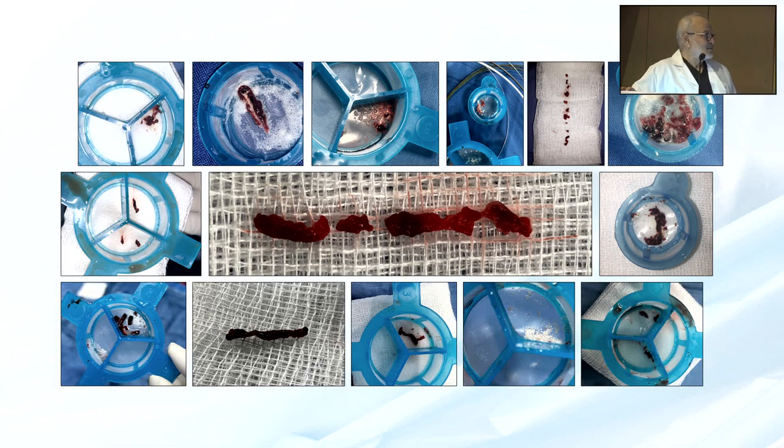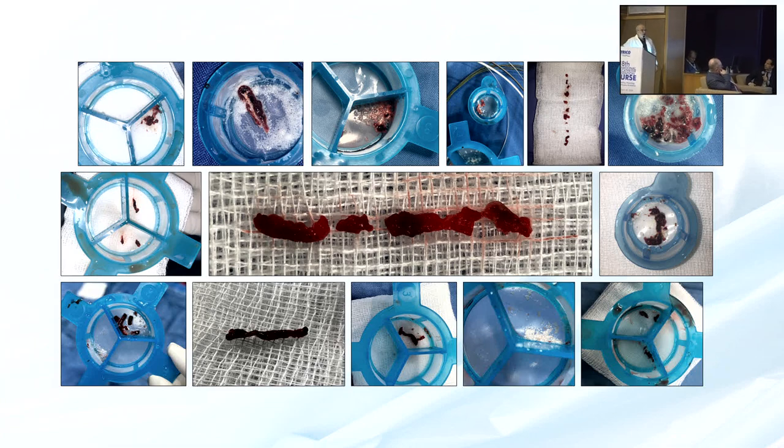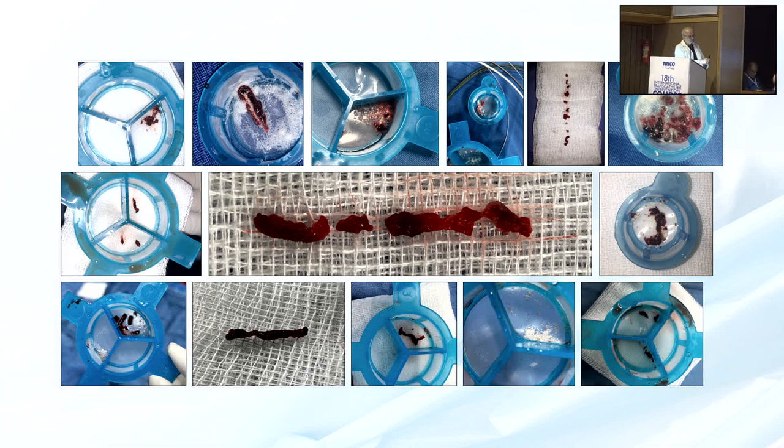Tej, if you had an embolization like a stroke, you must monitor for that, would you go and treat it in a similar manner? The first time, in that case I showed, I had to remove my guide. I make sure that I don't come out with the guide. Most of the time, once you suck the thrombus out, it is filled, and then I remove a 50 cc syringe and allow a free bleed for 50 to 70 ml. And then again I will close, considering that now there is no thrombus inside the guide lumen.